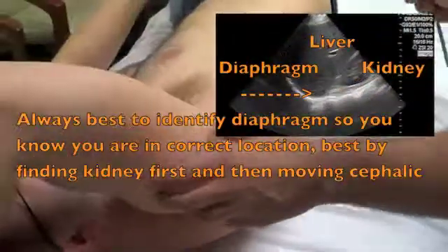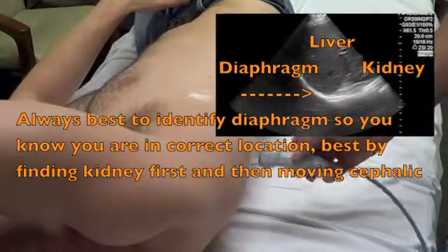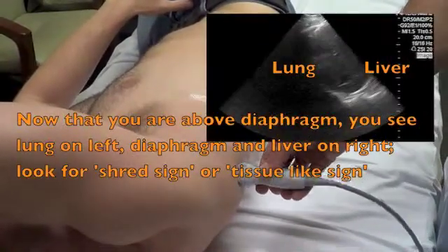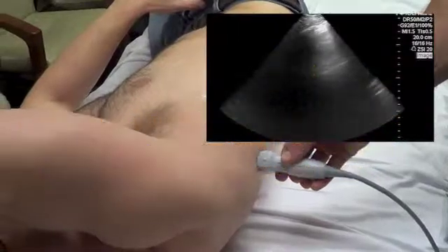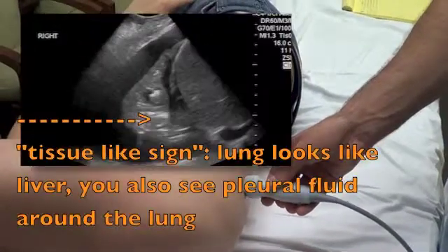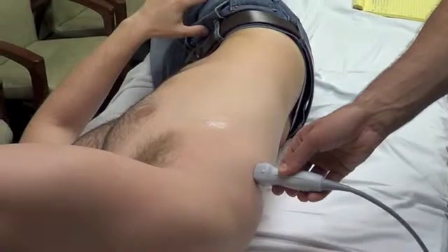You actually ask the patient to go into his left lateral decubitus position, as you see here. Then very briefly, you would place the ultrasound probe and find an area between two ribs and look at the lung tissue in there. If you see consolidation, typically you'll see things like a tissue-like sign and other findings consistent with a consolidation.